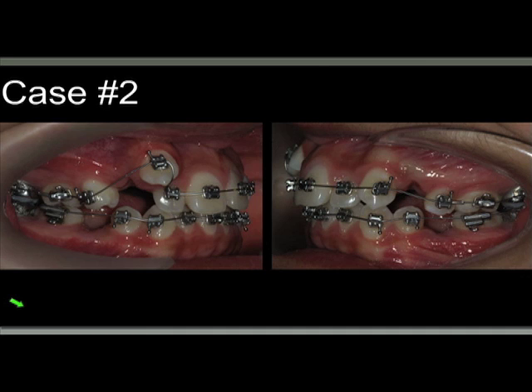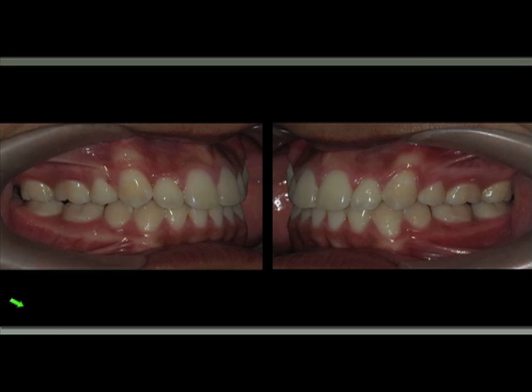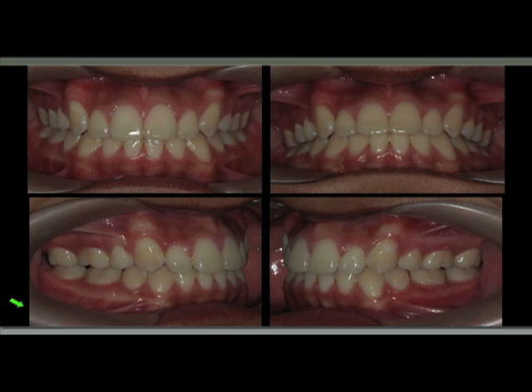The next case, case number two, is an extraction case where I removed upper first bicuspids and lower second bicuspids, with minimum anchorage in the lower and medium to maximum in the upper. You can see the first wire the day we place the braces. That is the last wire with some fine tuning, and this is the case finish. That's another view over here, the frontal view.